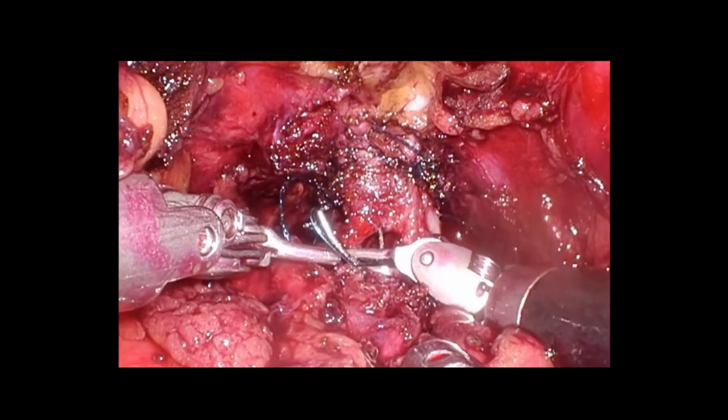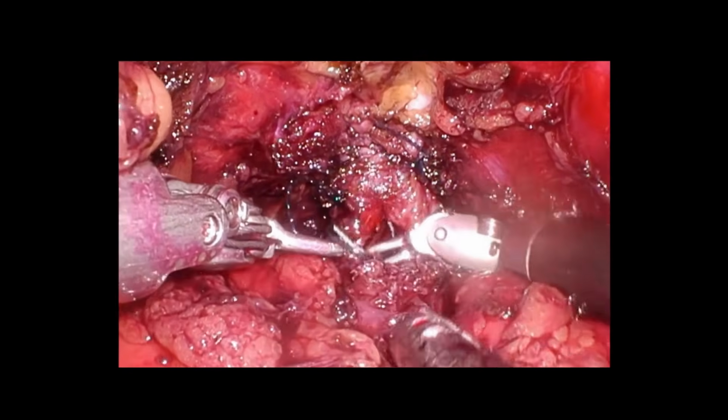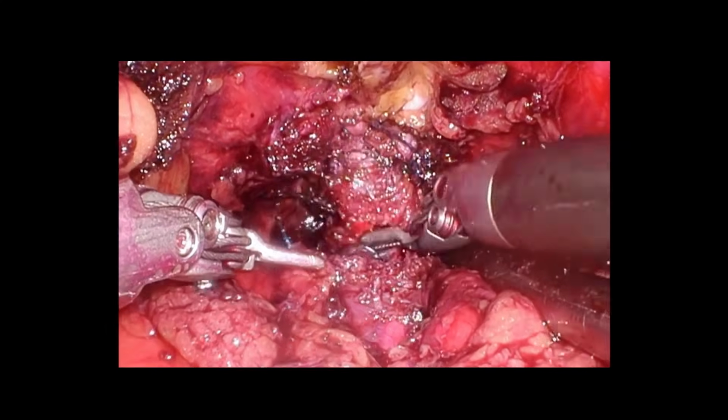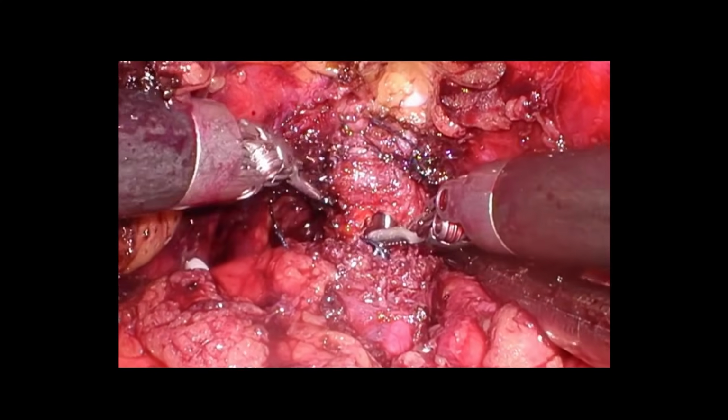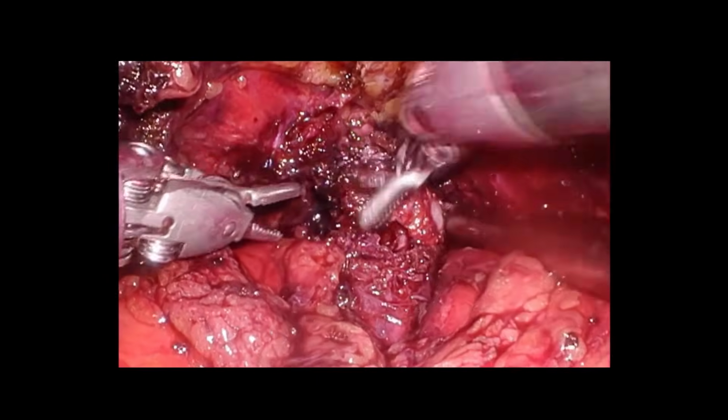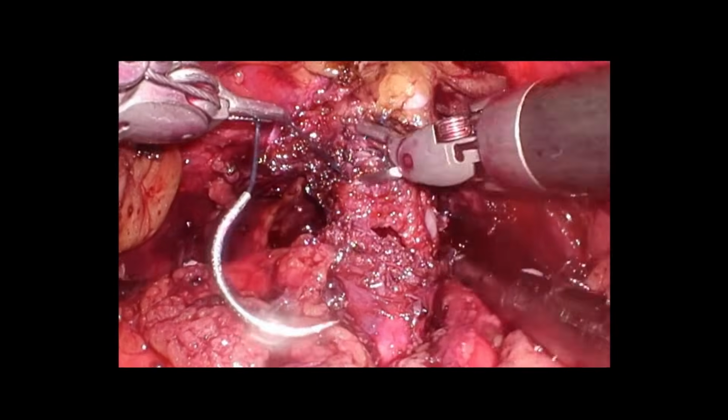It doesn't make any difference whether it's extraperitoneal or transperitoneal during this phase of the reconstruction. But make sure that you take only the urethra, not the anterior DVC, in the anastomosis.